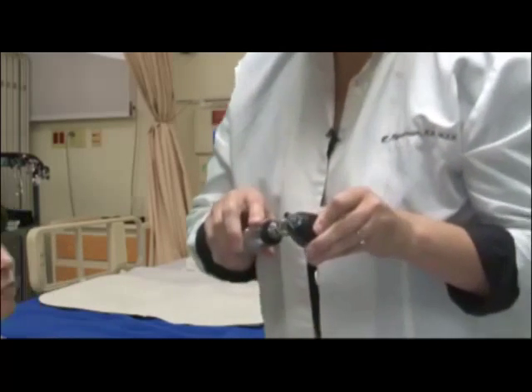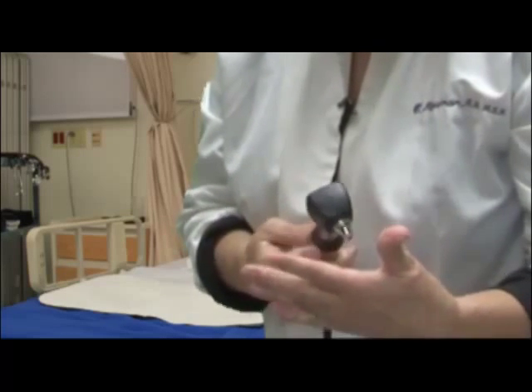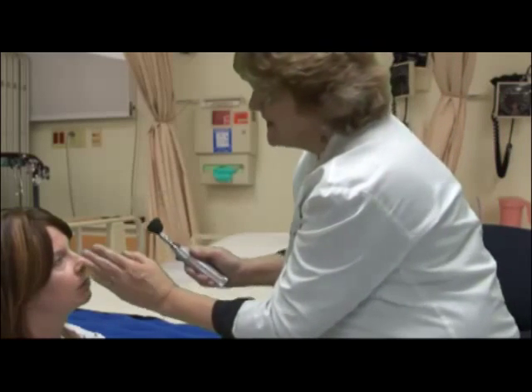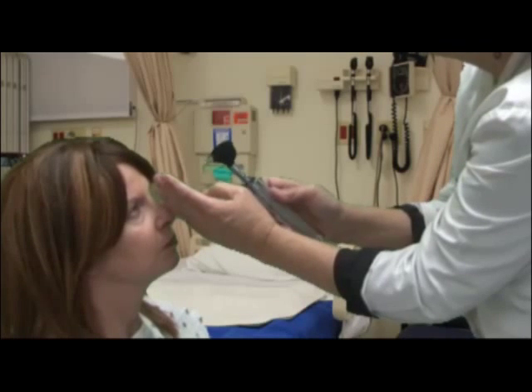In order to do the next pupil test, I'm going to actually put on the otoscope light because it's a little bit bigger, I think. And what I'm going to do now is check that her pupils are equal, round, reactive to light, and then I'll show you accommodation. All right, again, looking straight at me. I always put my hand up by the nose, but I'm going to bring the light from the side, and I'm shining the light into this side of the pupils.